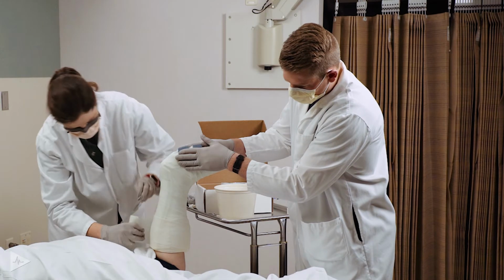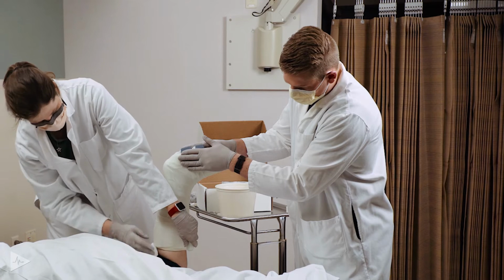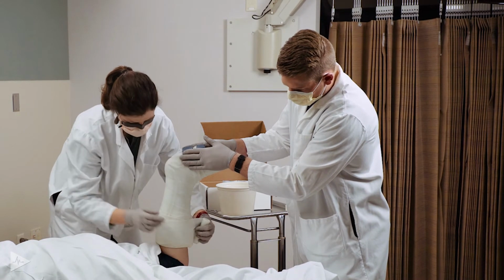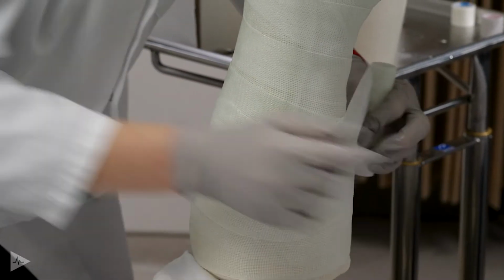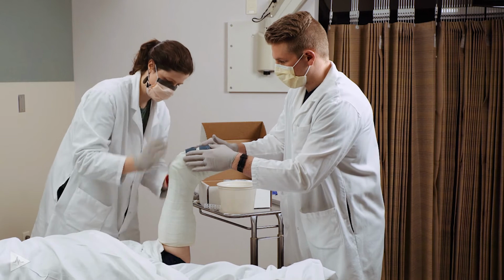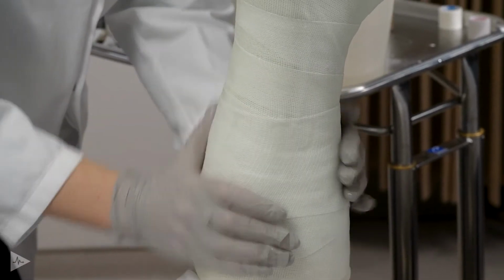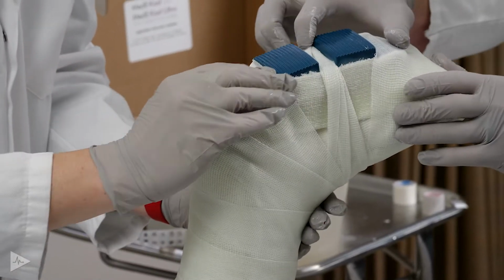And then you want to bring that right up to the edge of the cast. Try not to go over the sock at all, because then that can dig into the patient's skin, and you can just bring any excess back down the cast. Just get your fingers a little wet, rub that cast, seal all those fiberglass layers together. Go back, make sure everything is lying flat around the peg.